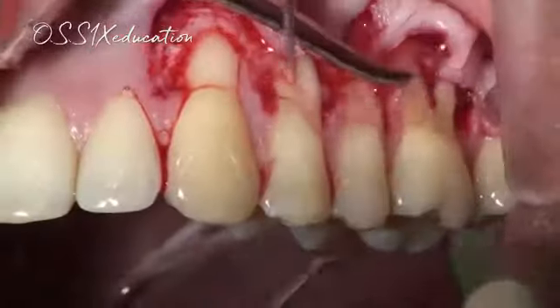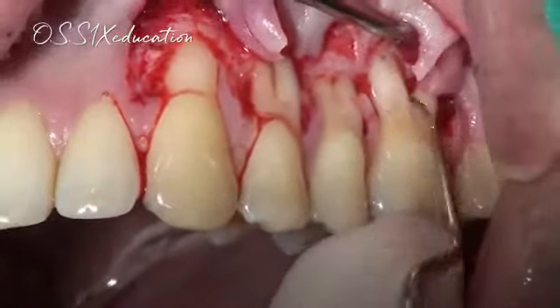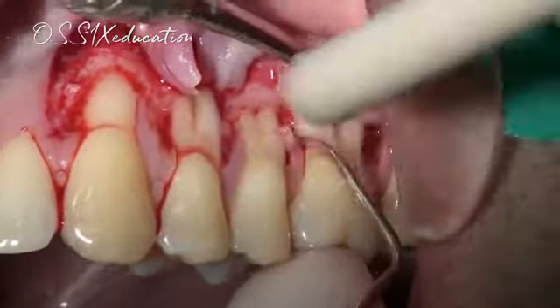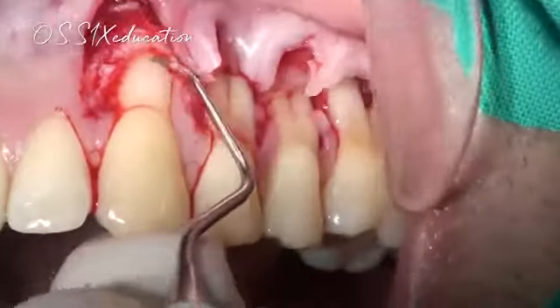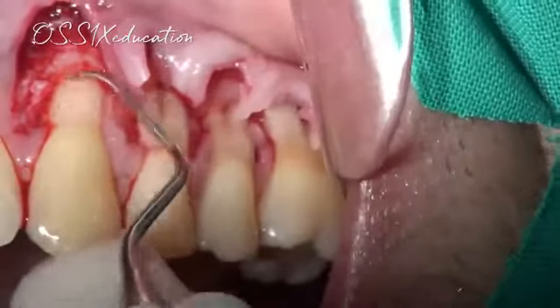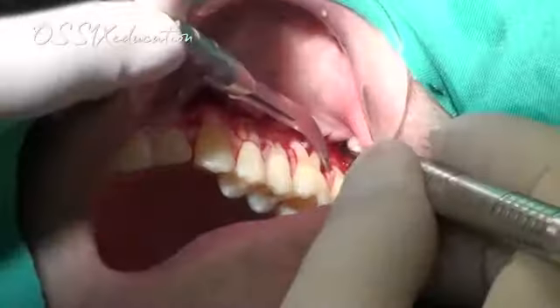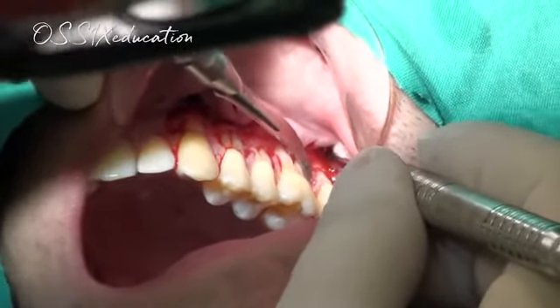Some irregularities. So now the root surface looks much better. The mesiobuccal root surface, I'm sure it's going to be better. Just a little bit more scaling on the canine. Never enough. Okay, now the surface is really smooth. Really, really smooth.